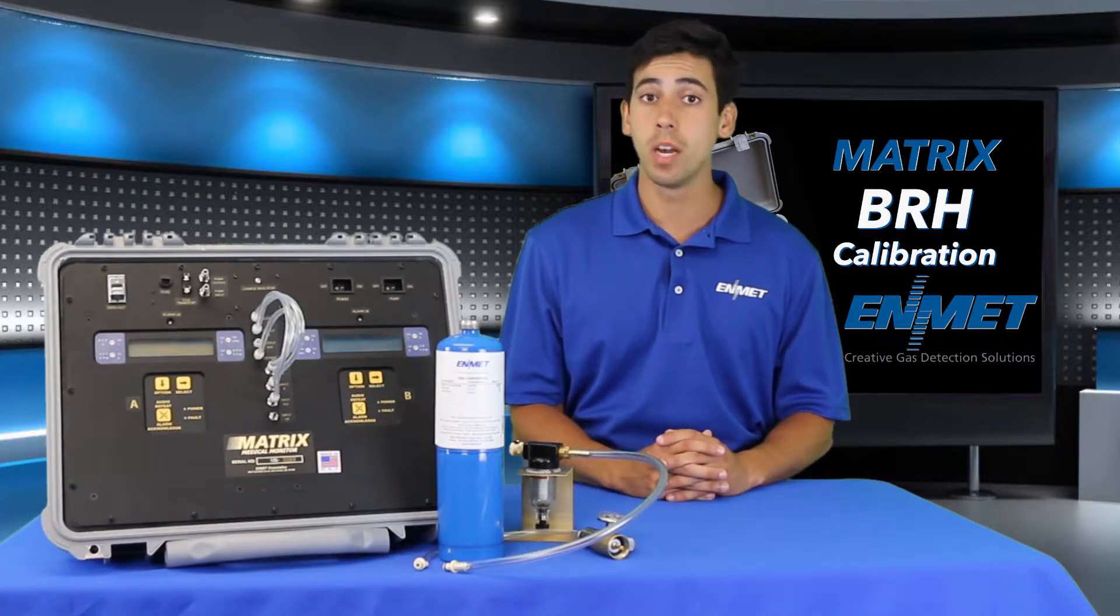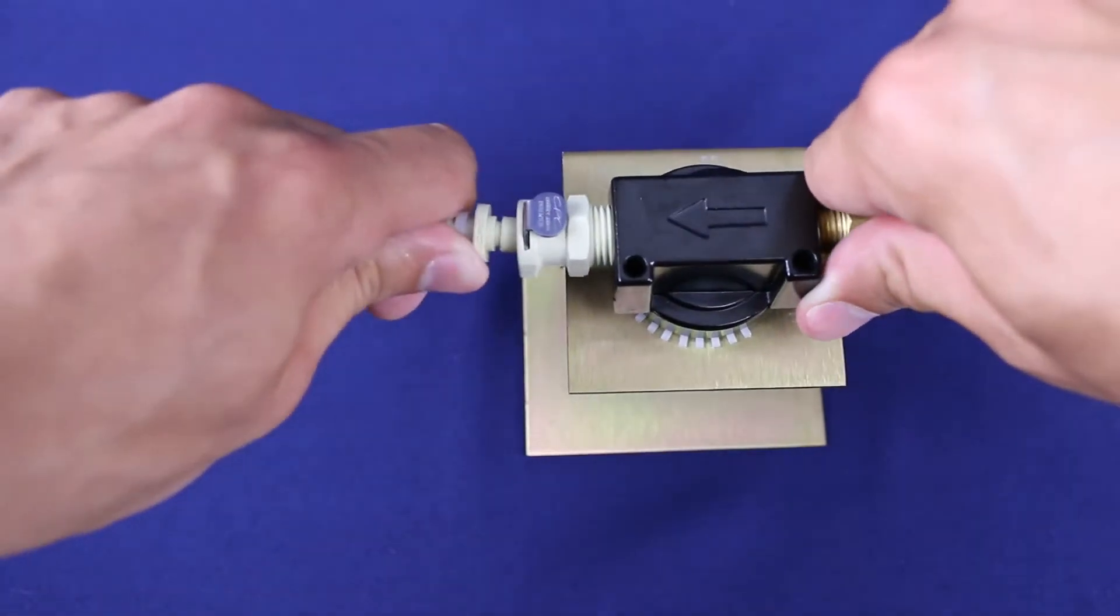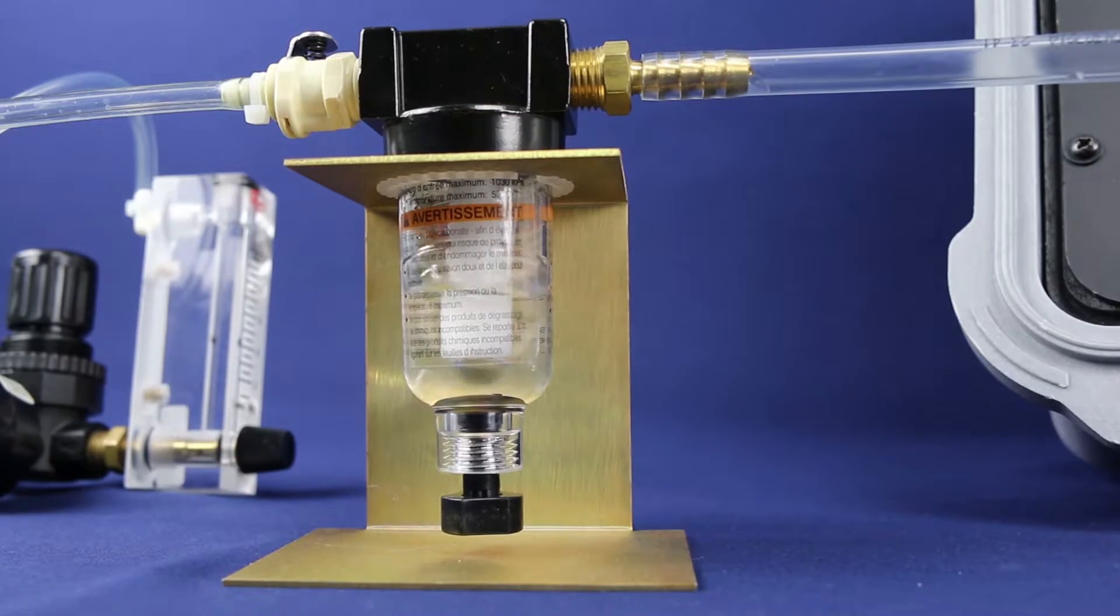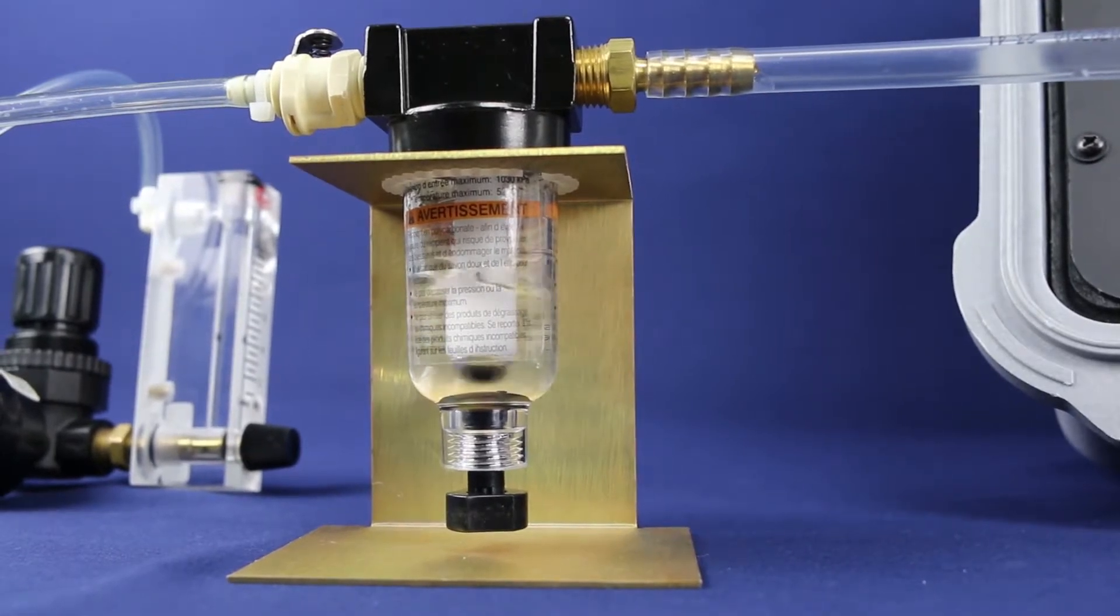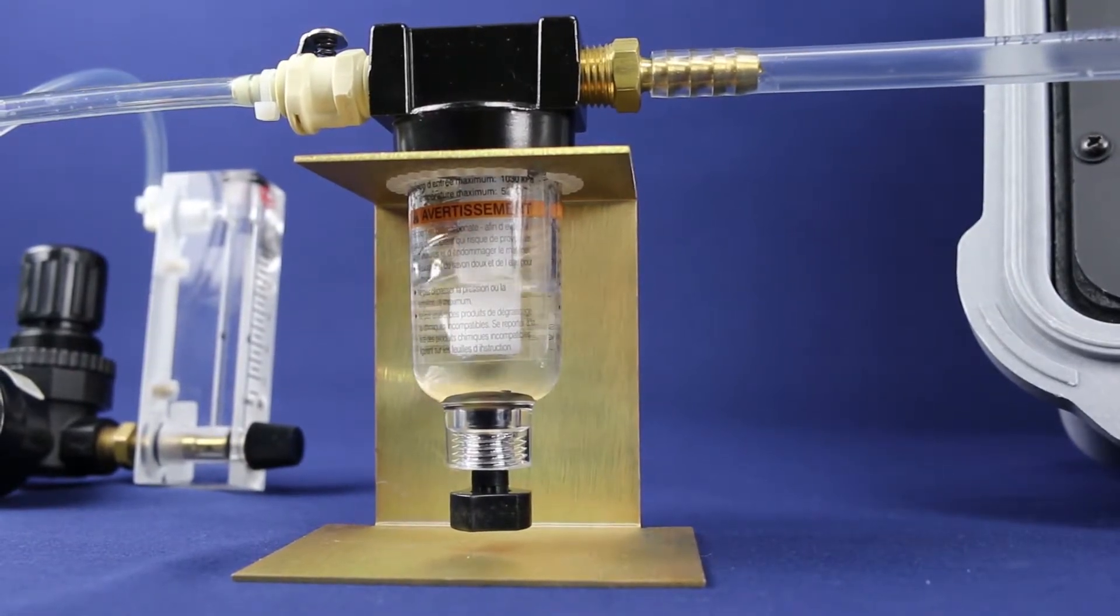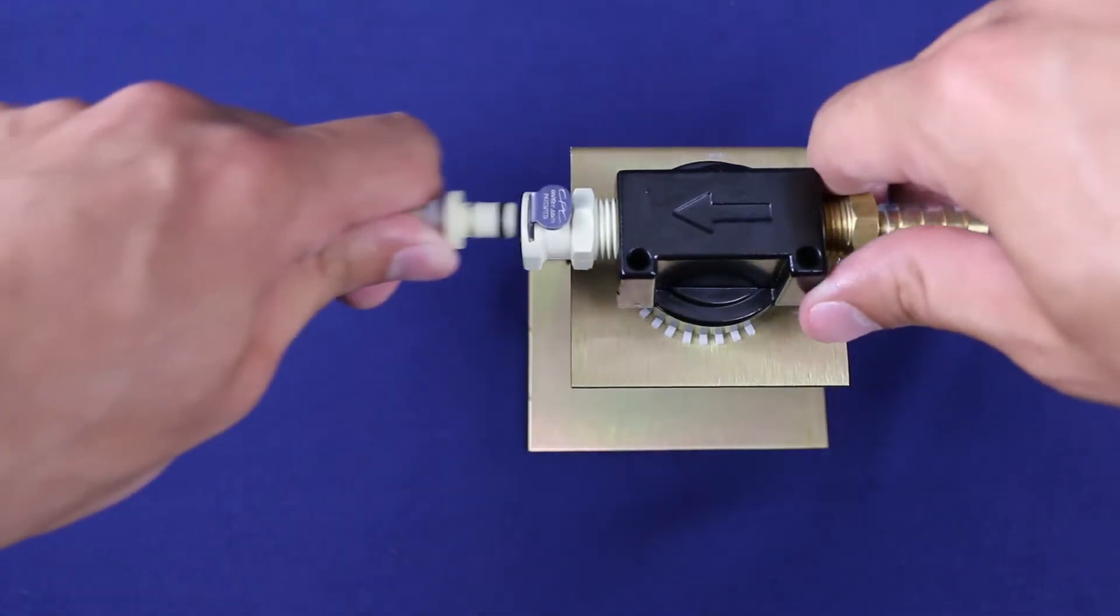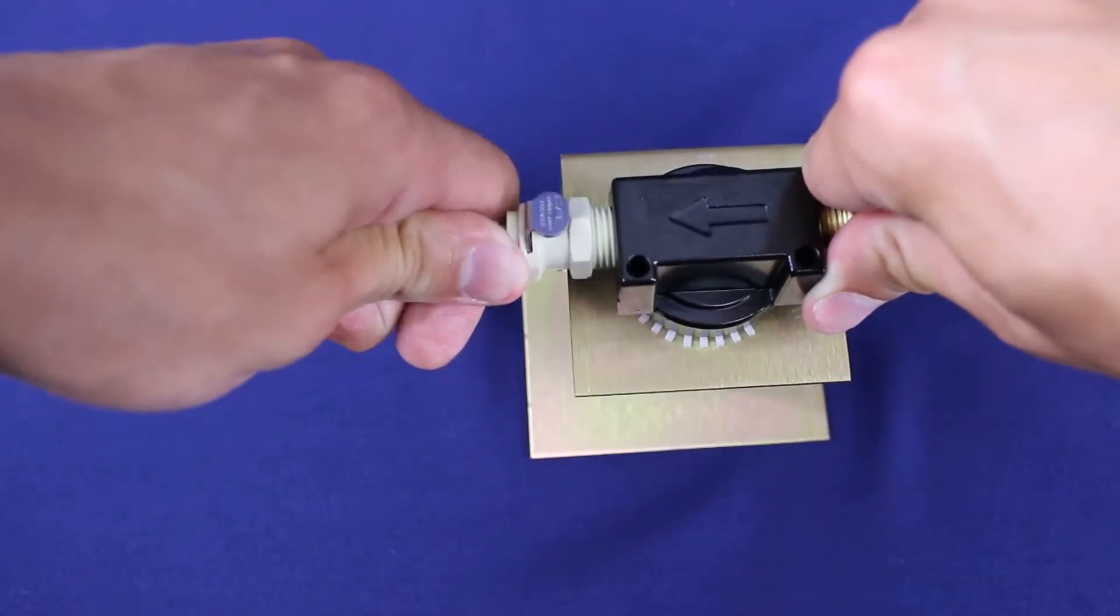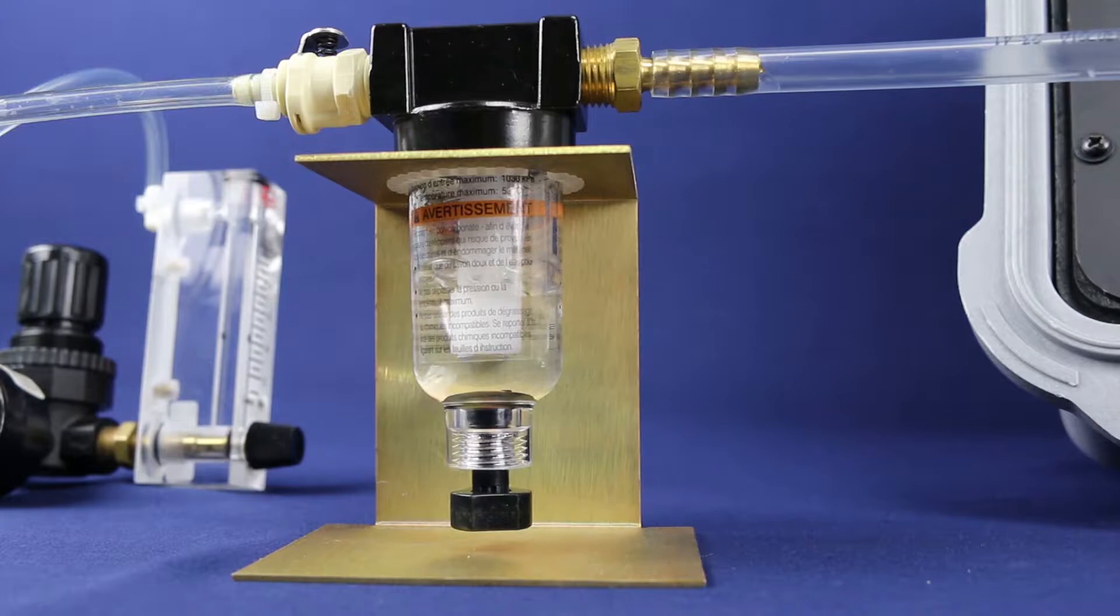The bubbler assembly must be attached with the arrow pointing at the supplied air source. Use caution and make sure that you hook up your bubbler assembly correctly. If incorrectly hooked up, water can get into your matrix unit causing damage to the sensors.